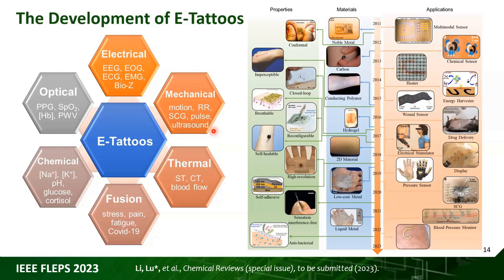Personally, I think wearable ultrasound is emerging and very promising, because ultrasound can give you the real-time hemodynamics of the blood flow and the mechanical deformation of the blood vessels. But even with those sensing modalities, to really extract blood pressure accurately, you also need very good biomechanics models that can use those non-invasively measured parameters to extract blood pressure.